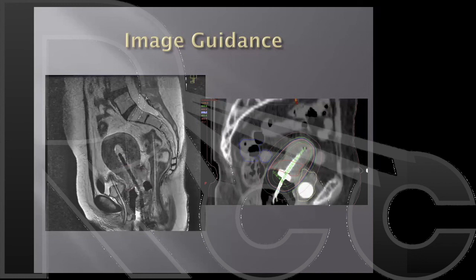So you can actually pull back your isodose curves a little bit if your MRI shows a favorable response, but we still do treat the entire cervix in patients. I don't know if that discussion made sense.